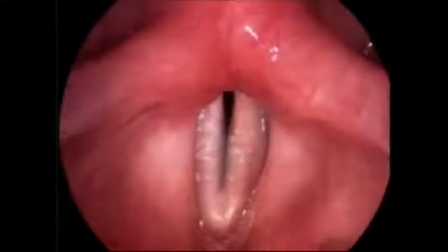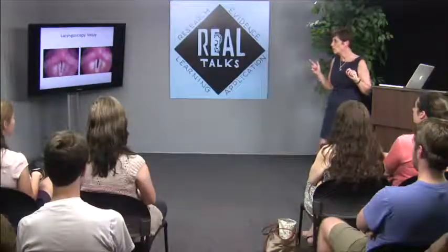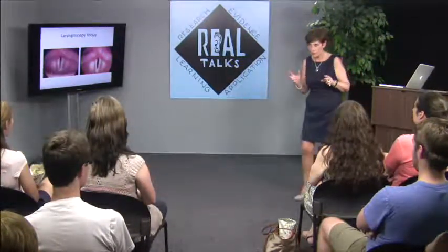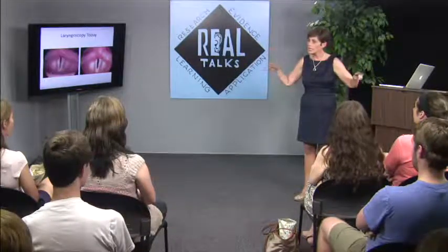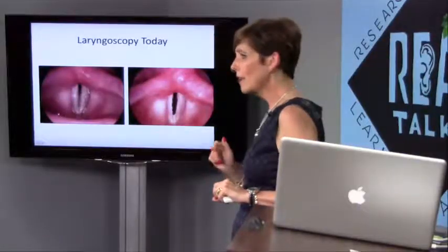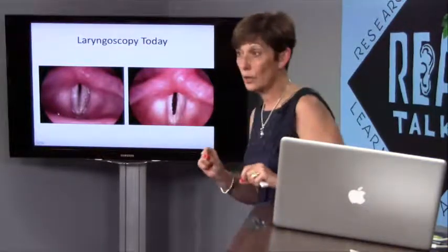Even though it may seem a little jumpy, the reality is when you look at the vocal folds with the naked eye, you are only able to see a blur. It's the hummingbird philosophy. When the eyes look at the wings of a hummingbird, the wings flap so rapidly that our eyes and our brain can't keep up, so all we see is the blur of the flapping. Well, our vocal folds vibrate so quickly, around 200 times a second for women and around 100 times a second for men, that the eyes can't keep up. So when we look at the vocal fold with just a scope in there with no advanced technology, all we see is a blur. That doesn't provide for optimal diagnoses if you can't get a good picture.